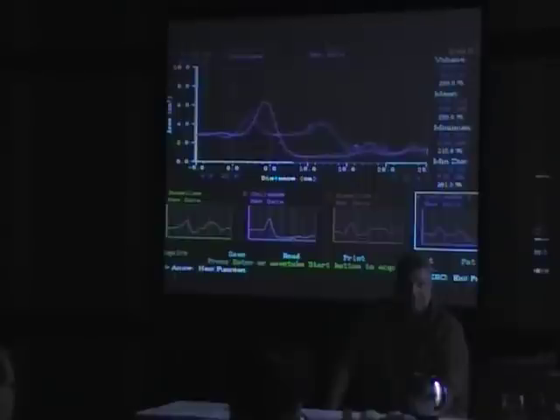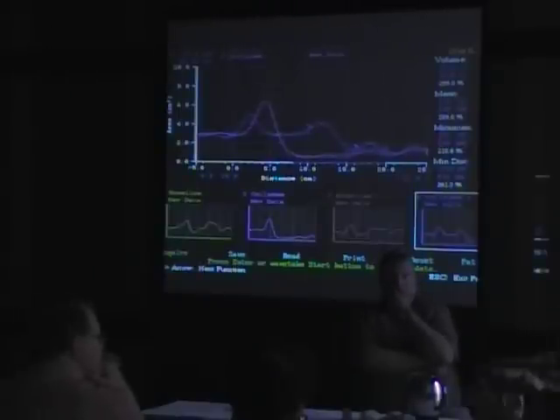Remember, once you reduce the negative air pressure on the lumen of the epithelium, it is going to do what? It is going to shrink, which will do what to the caliber of the airway? Open that up. So what you're doing is comparing the absolute best case scenario to nearly the worst case scenario, and look at the result. Do you see a change in his airway?